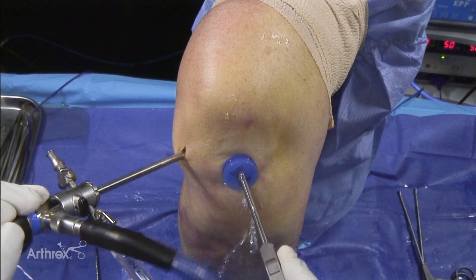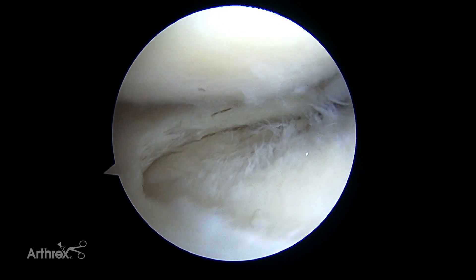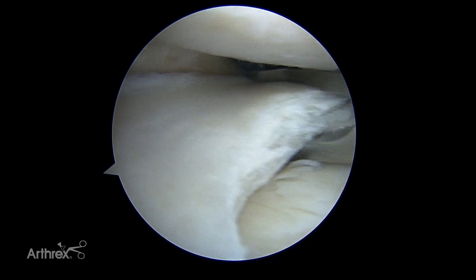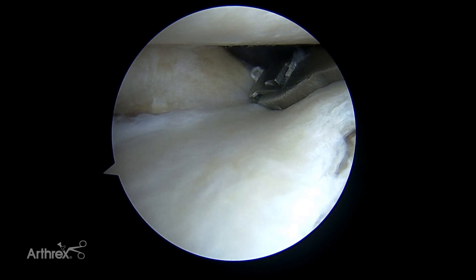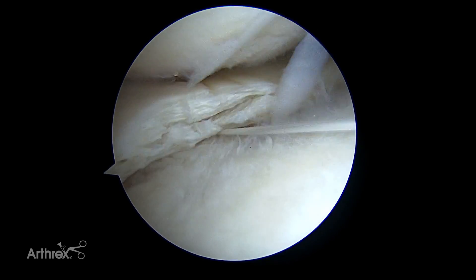I'm going to go in through a passport cannula first for ease of suture management. I'm going to come across here and go circumferentially around this — we're going to go into the very posterior part of the meniscus and pass our stitch here. As the fast pass, it'll grab the suture and I can come back around it.